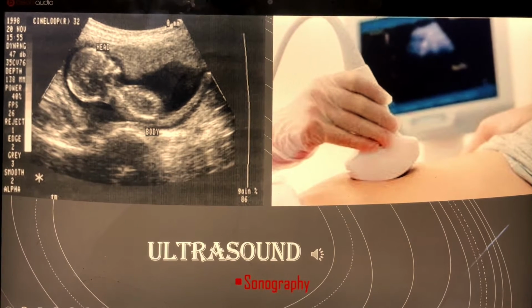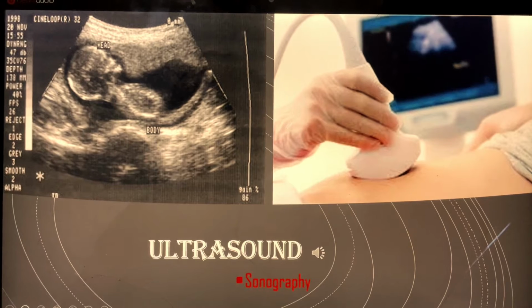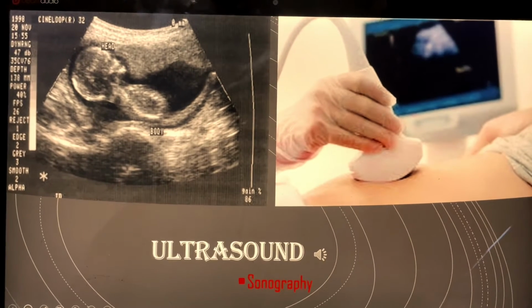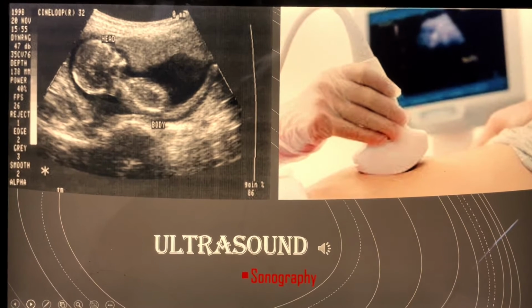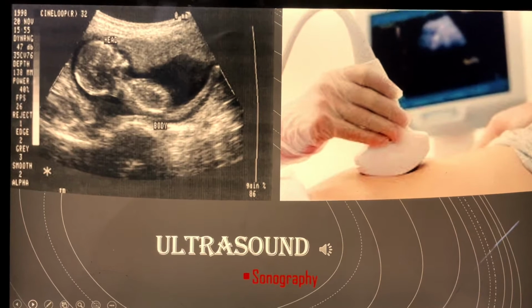This also affects the human body once it enters. Depending on the doctor, sometimes they require you, what I've heard, most people that do ultrasounds, they always require you to drink a lot of fluids. And I guess that helps you capture the better image that is required.